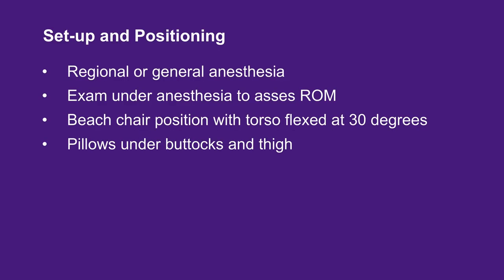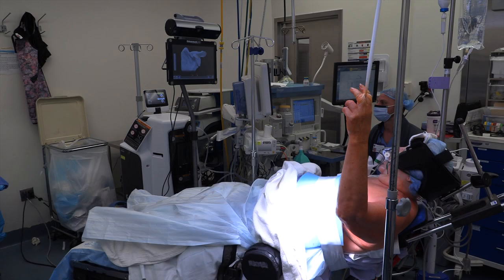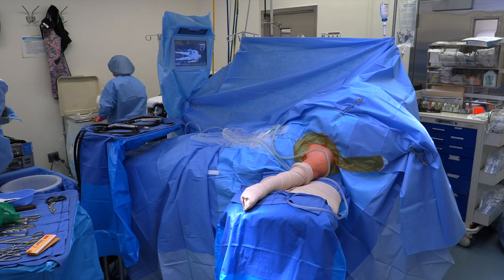The patient is taken to the operating room where, after administration of either regional or general anesthesia, an evaluation under anesthesia of the shoulder is performed to assess passive range of motion. The operating table is placed in the beach chair position with the torso forward flexed at 30 degrees, and pillows are placed under the patient's buttock and thighs. The 3D navigation system is installed and the shoulder and upper extremity is prepped and draped in a standard sterile manner.